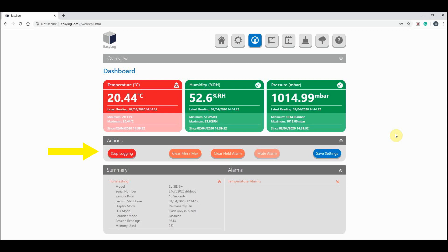In this action section, we can ask the logger to do a number of things. We can stop logging altogether, we can clear the min and max readings we currently have, we can clear any held alarms, and we can also mute the sounder.